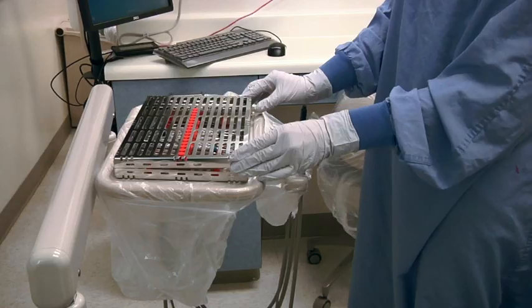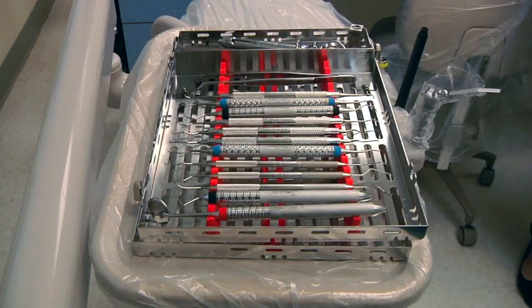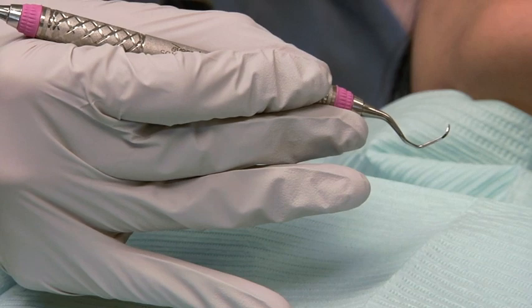Prior to the initiation of treatment, ensure that all instruments you will need for the procedure are in place. The instrument cassette should be placed on the bracket tray, and the advanced instrument cassette should be conveniently at hand if you are planning to use an advanced instrument such as the Gracey 1718. Steps for using the Gracey 1718 are as follows.